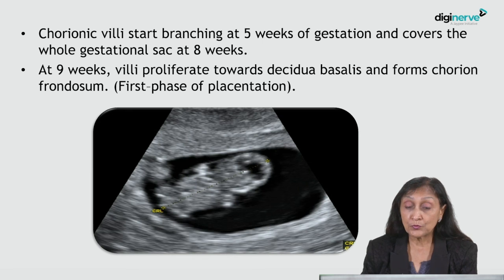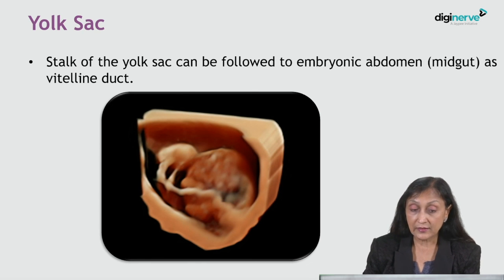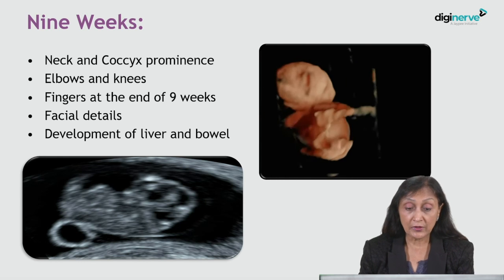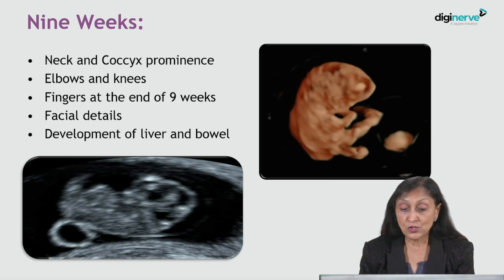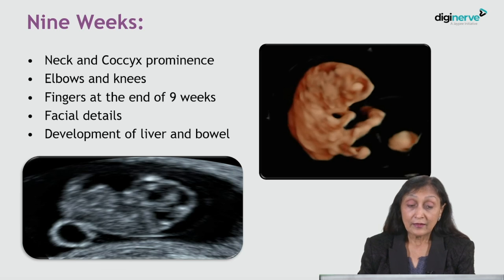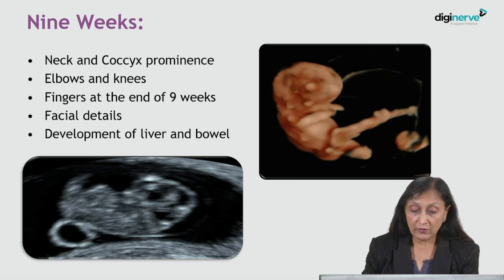At nine weeks, the villi proliferate towards the decidua basalis and form the chorion frondosum — this is the first phase of placentation. The stalk of the yolk sac can be followed to the embryonic abdomen as the midgut via the vitelline duct. The neck and coccyx prominence are clearly visible, and the elbows and knees are formed. Fingers can be seen at the end of nine weeks. Facial details are also appreciated at this time, and development of the liver and bowel can be documented.